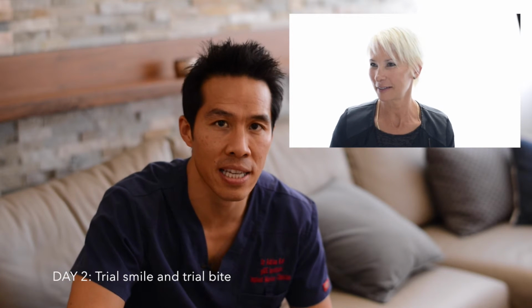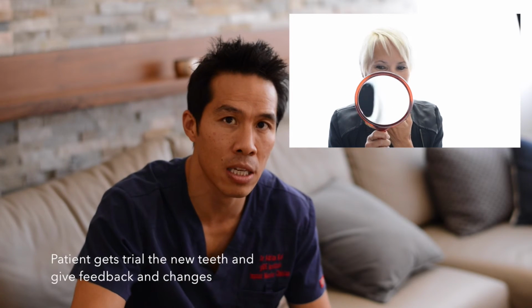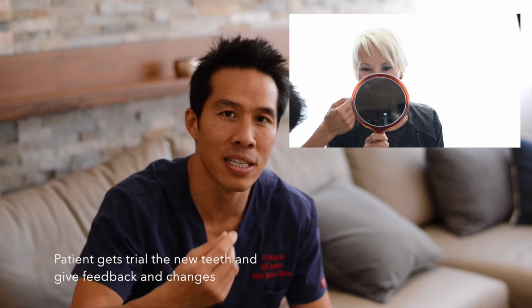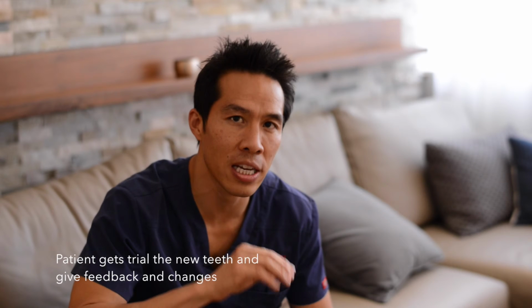So that usually happens on a Monday. By Wednesday, we will have all the teeth set up in wax. So this is what we call the trial smile. So 2 days after surgery, the patient will come in and we will fit those trial smile teeth on top of the implants. The patient then gets to see exactly what the teeth look like and also check that the bite is 100% and even.